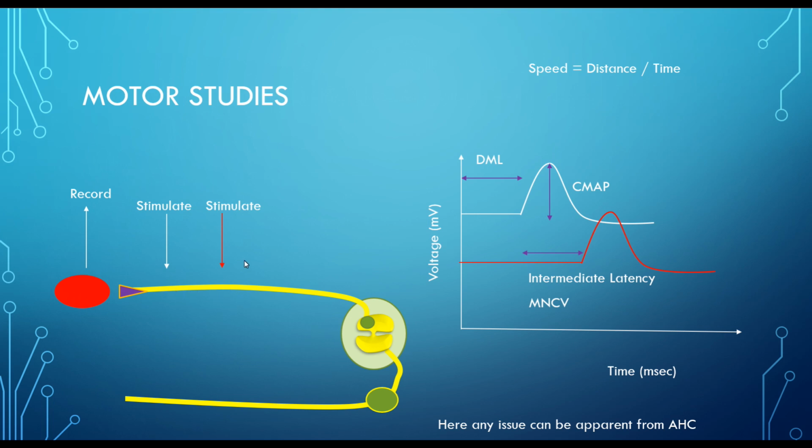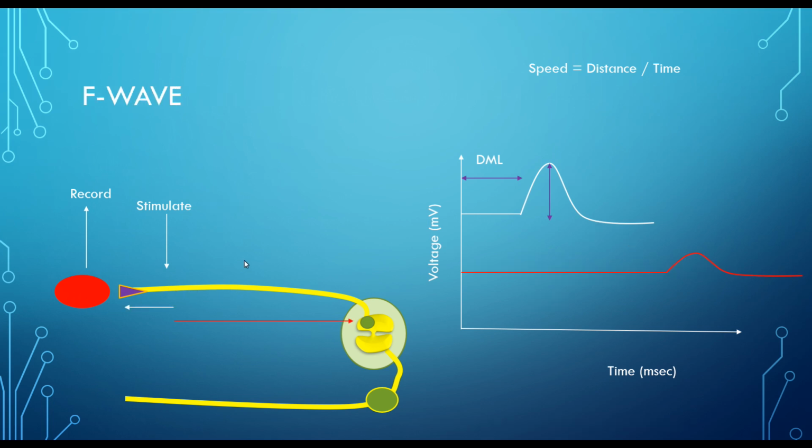The F wave, just to show you again: as we stimulate at any point over here, the depolarization will spread in both directions. The first thing that happens is you get the M response directly from the muscle itself. At some later point, one gets the comeback tickle, as it were, from the anterior horn cells, which then go and stimulate the muscle fibres again, and that's about 10% of the response.